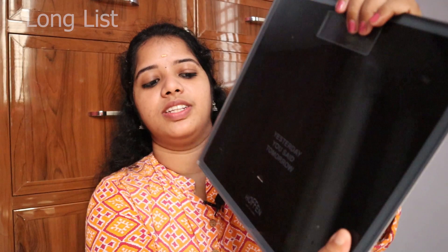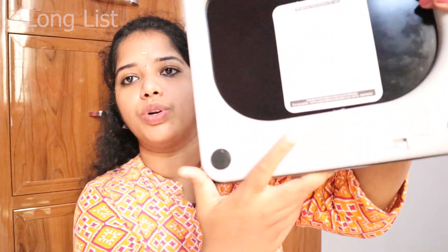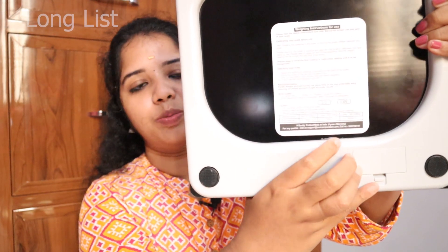The paint on the back side is black color, and it looks good. Overall, I give this product a rating of 9 out of 10.